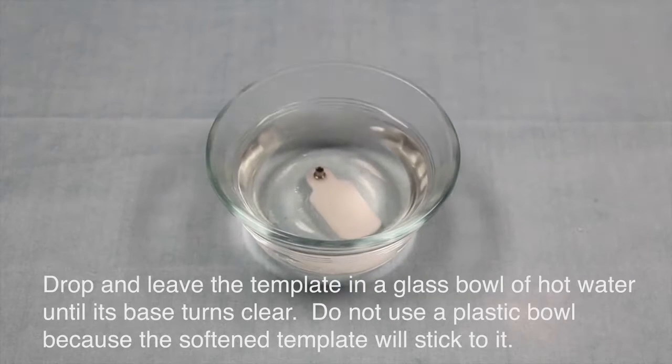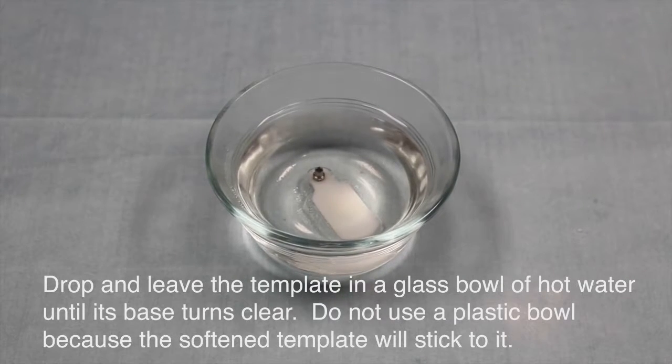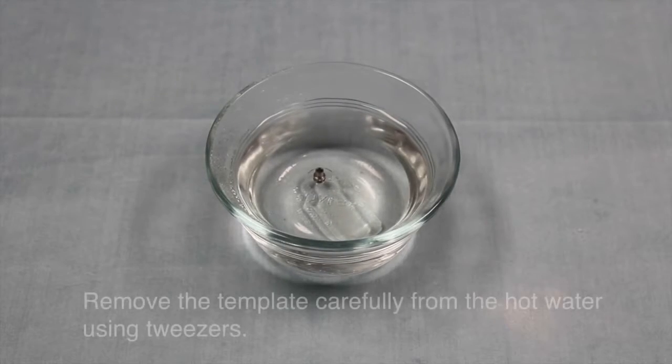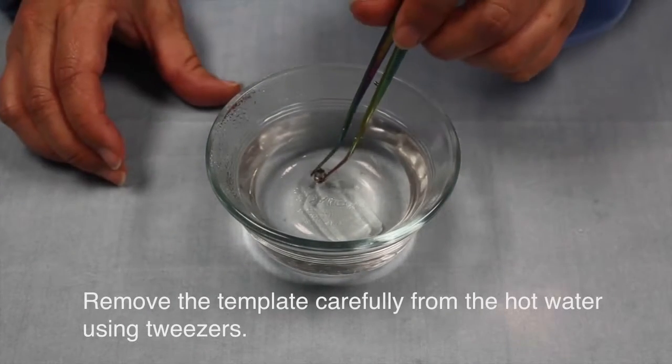Drop and leave the template in a glass bowl of hot water until the base turns clear. Do not use a plastic bowl because the softened template will stick to it. Remove the template carefully from the hot water using tweezers.